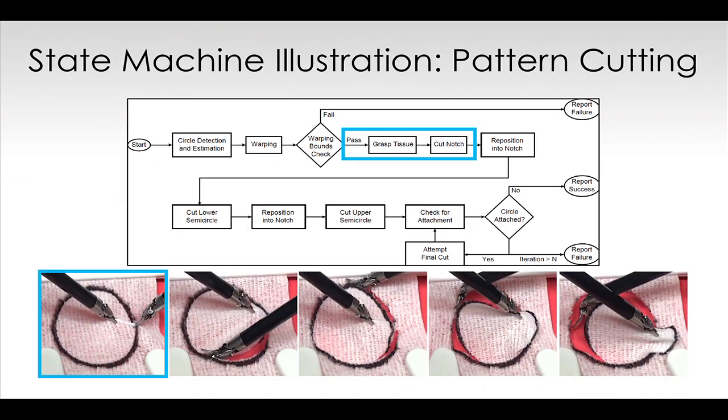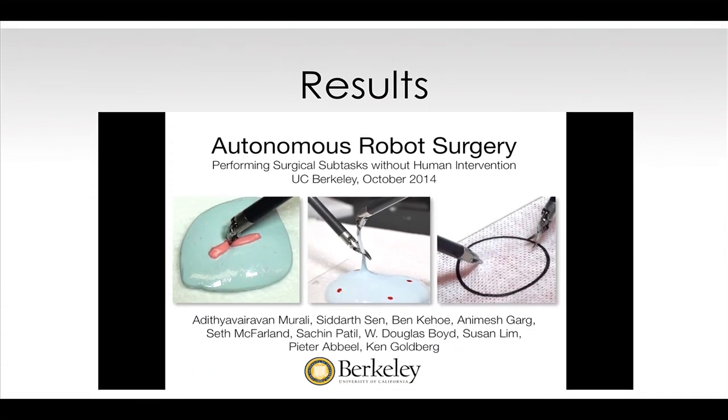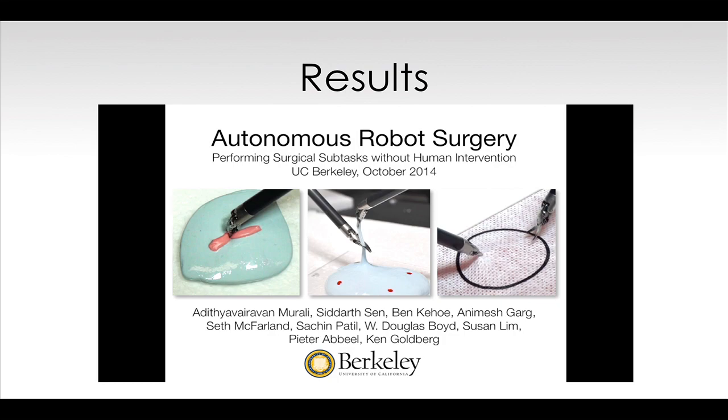In the pattern cutting task, the robot starts by making the first notch in the gauze. Thereafter, it cuts through the lower semicircle, then the upper semicircle. One of the important aspects of using these finite state machines is that we get some error recovery behaviors for free. For instance, in this example, the robot checks if the two semicircles meet. If they don't, then the robot goes in and makes the cut again. Let me show you some of the results from our work in action.